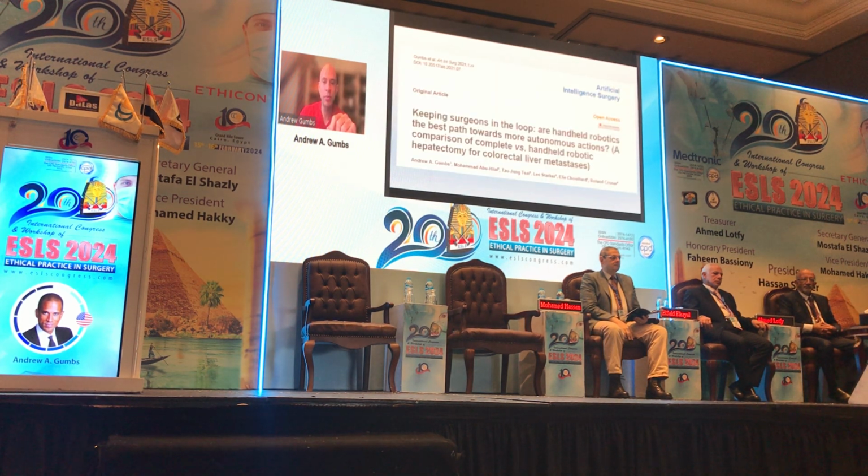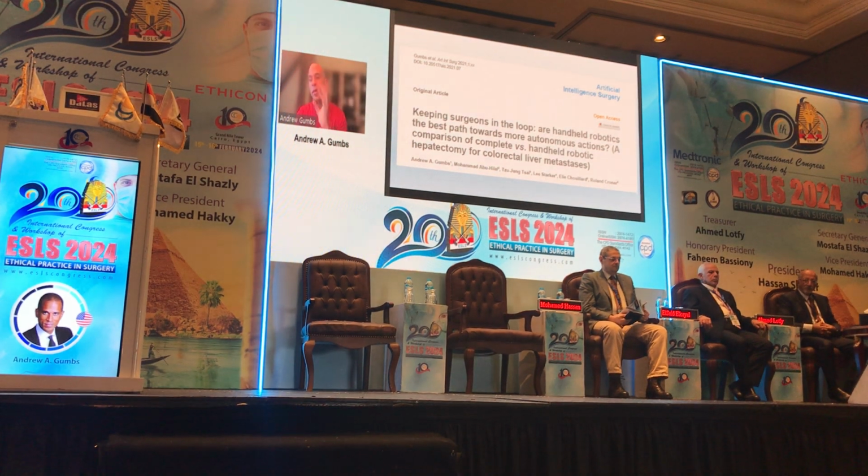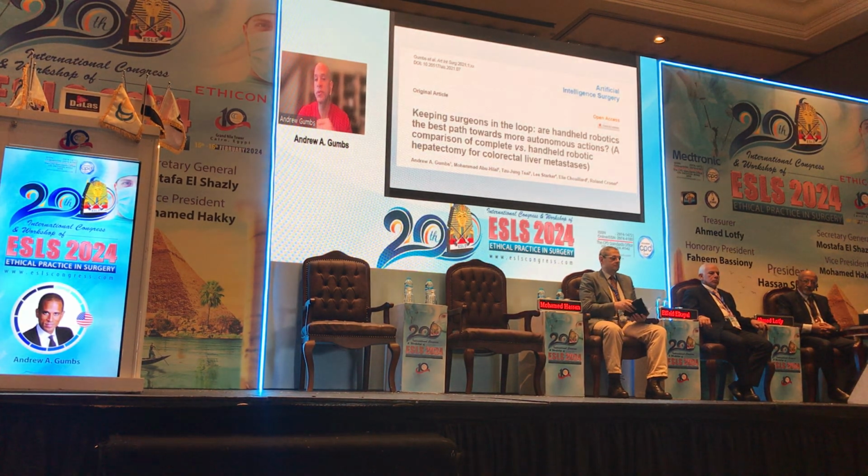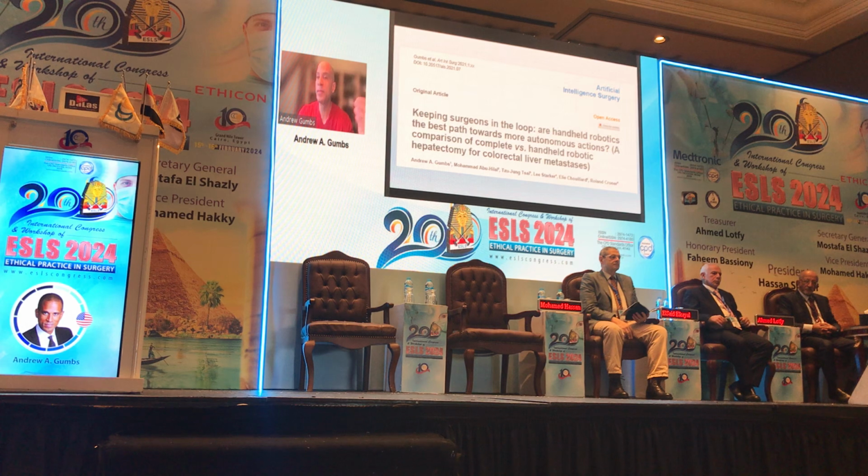To answer this, we wrote a paper called Keeping Surgeons in the Loop that discussed handheld robotics, comparing hepatectomy for colorectal liver metastases versus hepatectomy for patients that had surgery with the Da Vinci system. We found quite a few advantages with surgery that was done with handheld robotics. The bottom line was the vast majority of surgeries could be done minimally invasively when handheld robotics were used, on the order of about 87%, and only about 50% of hepatectomies could be done with the Da Vinci robot. So this is just an example of how handheld robotics potentially has an advantage.